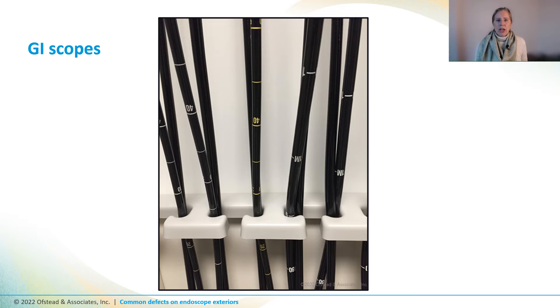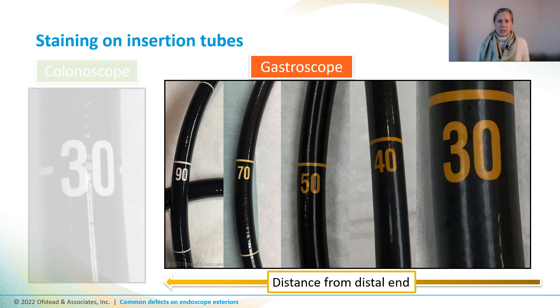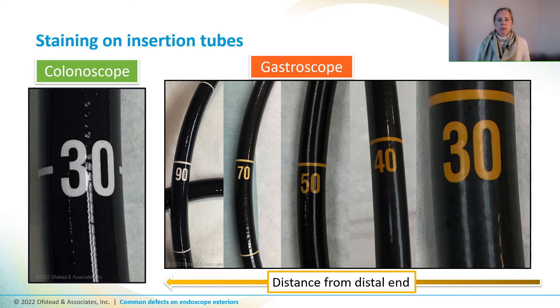When we looked in a storage cabinet for GI scopes, we noticed that some of the white centimeter markings looked kind of yellow or orange, like the 40 centimeter marking. We pulled the scope out and noticed the numbers close to the distal end were dark orange or brown, while they were mostly yellow and white up by the control handle. Compared to a colonoscope in the same cabinet, which had bright white shiny numbers, this gastroscope looked dull. We wondered if the discoloration was from gastric acid or bile exposure in the stomach and sent it out for repair.